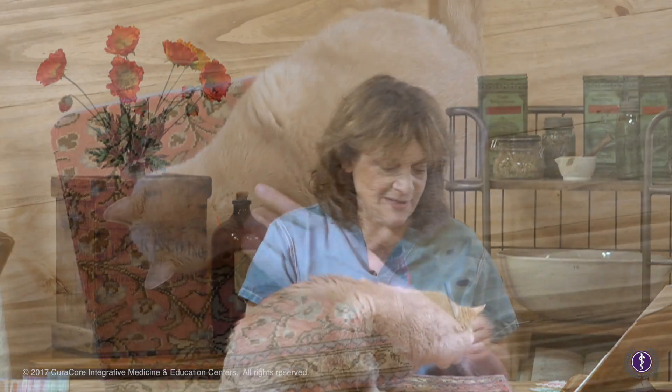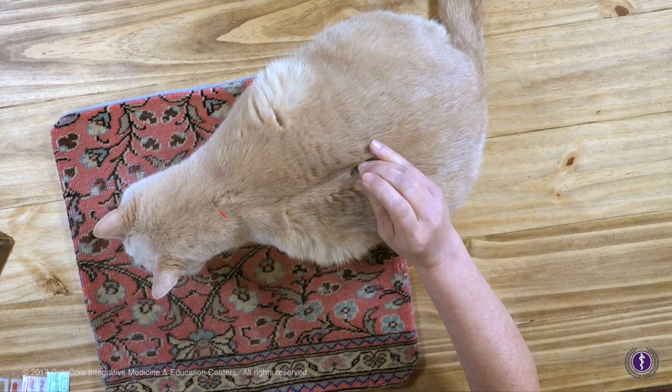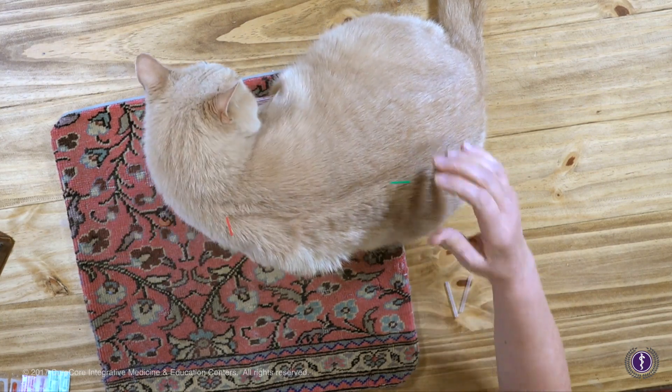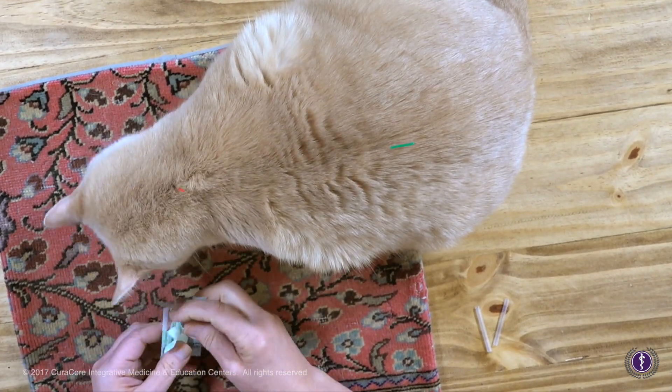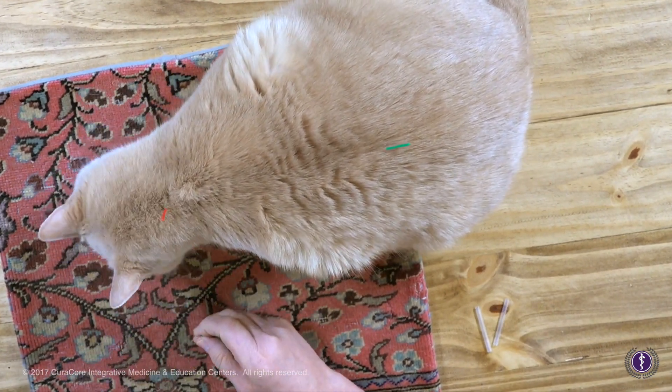Let's demonstrate some kitty needling. Fortunately this one is very entertained with his treats — everything's fine. Notice he had some back issues starting there. We don't want him to lick a needle, so allowing him to sit there, but he did.